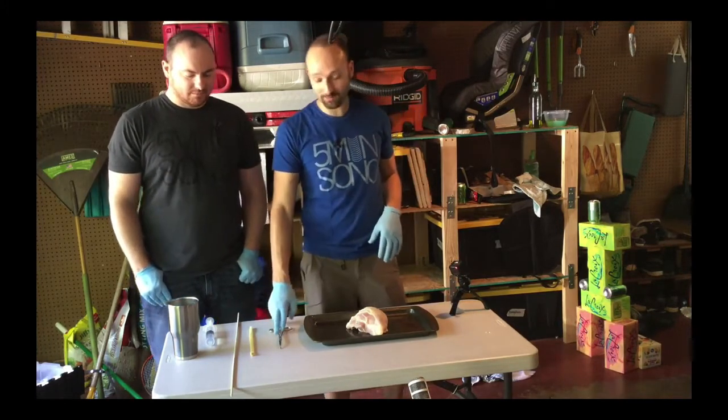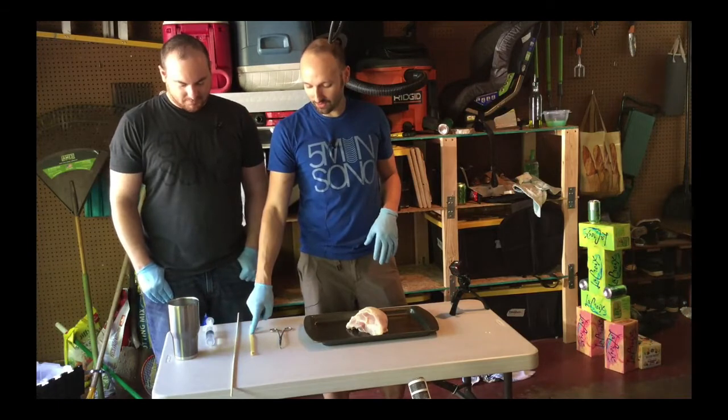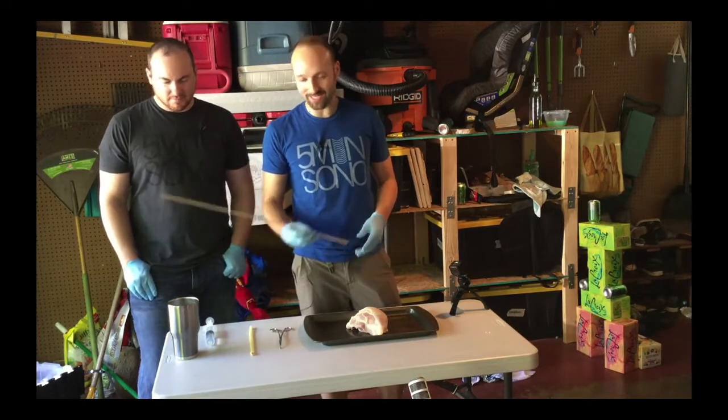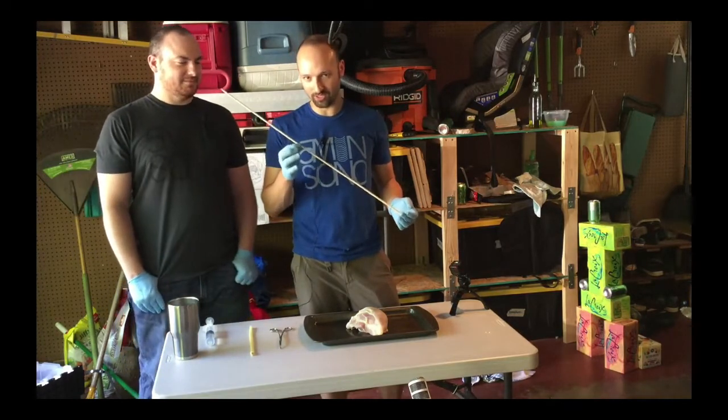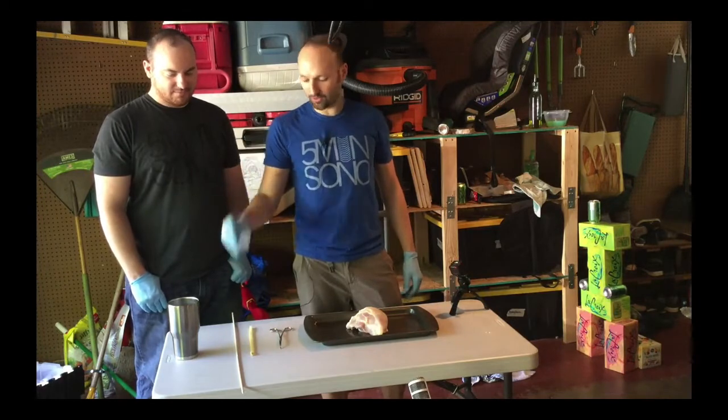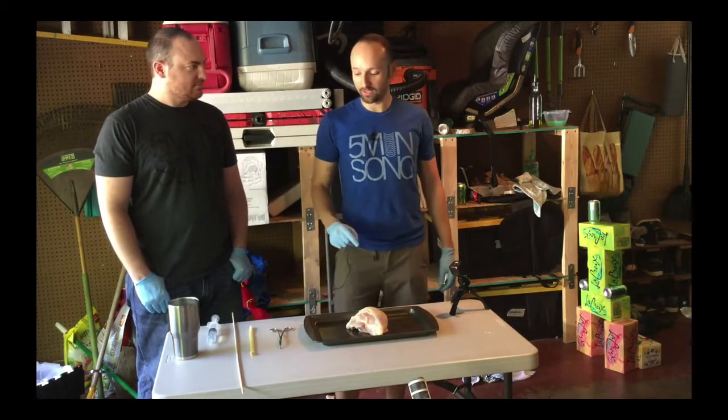We have some forceps. We have a little bit of latex tubing. You can get this on Amazon or you can just get a Penrose drain from your hospital. We have a skewer — definitely does not need to be this long, but I want to make s'mores later, so that's why I have this one. A little syringe to put the water in and a little water. That's really all that you need.